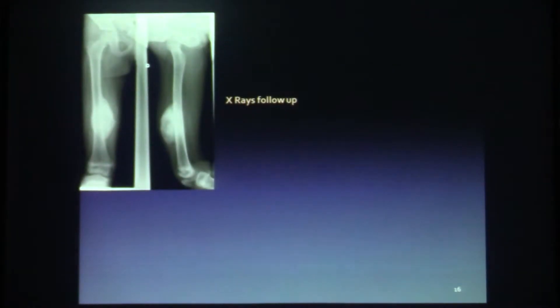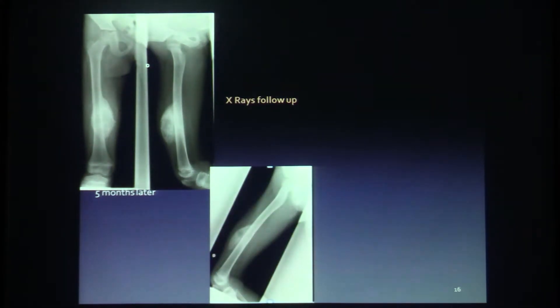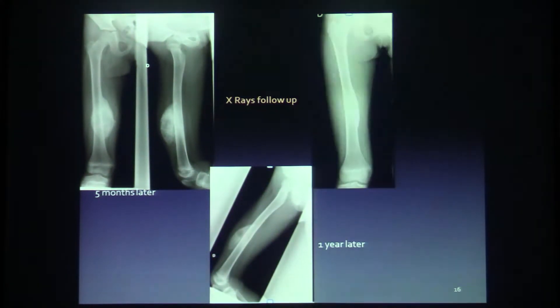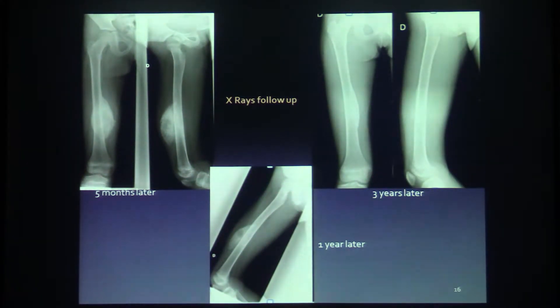In conclusion, progression of the dimension of the partially calcified lesion compatible with myositis ossificans circumscripta. As no intervention was required, there was simply X-ray surveillance, with images showing a progressive reduction of the lesion five months later, one year later, and three years later.